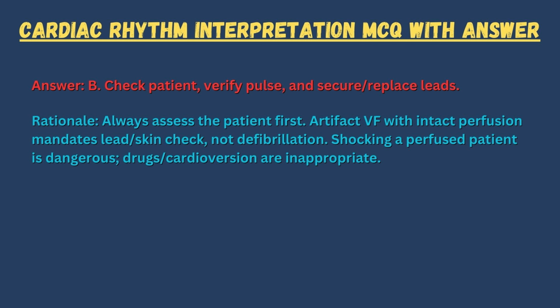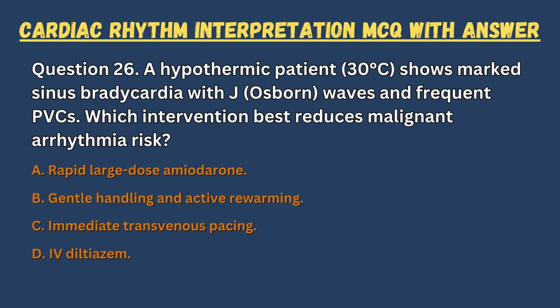Answer: B. Check patient, verify pulse, and secure/replace leads. Rationale: always assess the patient first. Artifact VF with intact perfusion mandates lead/skin check, not defibrillation. Shocking a perfused patient is dangerous. Drug/cardioversion are inappropriate.